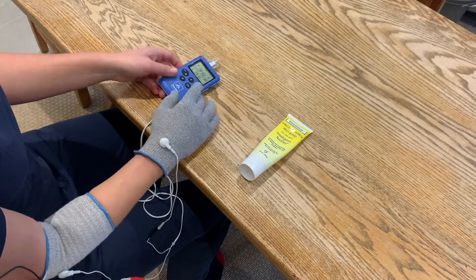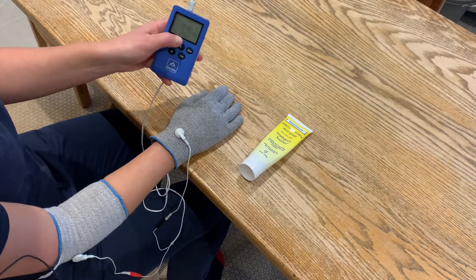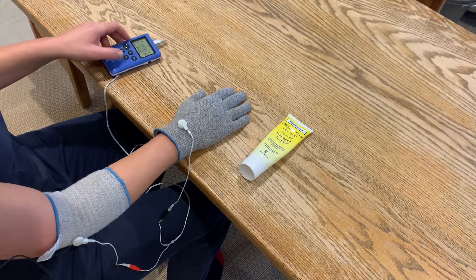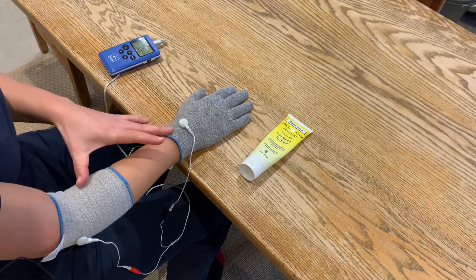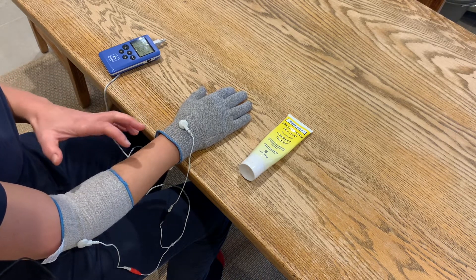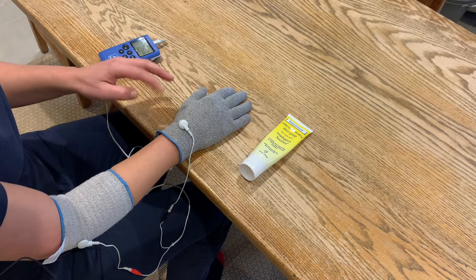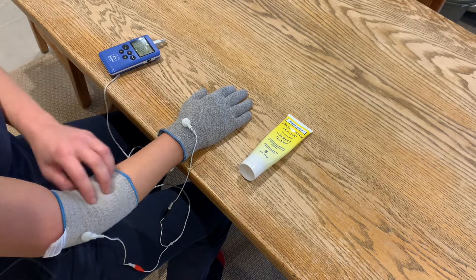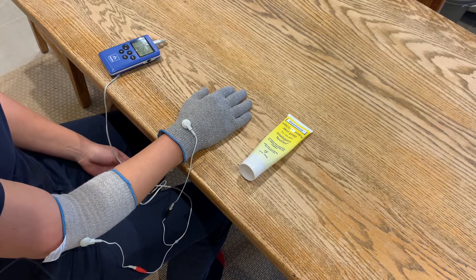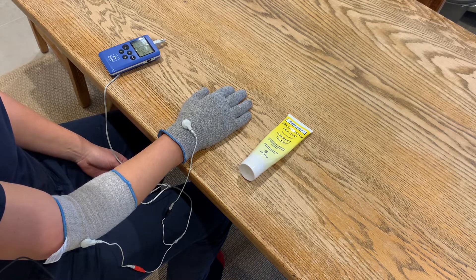The program is now running on its own with a countdown clock for 30 minutes. Please note you won't see any movement or muscle contraction — this is a very gentle stimulation to the sensory system via the glove and sleeve, sending messages to the whole of the arm. That's you set up.